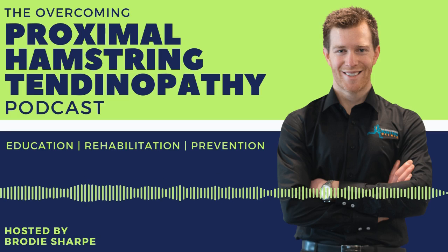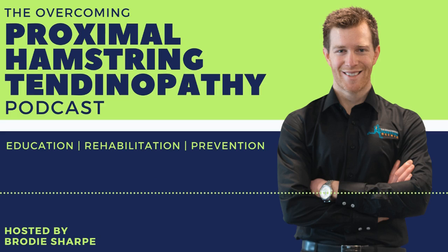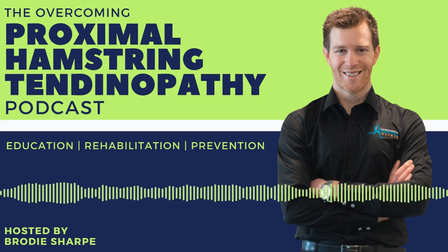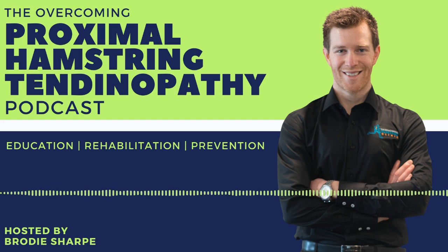A lot of patients call me after 3 sessions and tell me they're not happy. And I say to them, your tendons, your collagen remodeling and everything, it takes a good 12 weeks. So we need to educate patients. Most patients, when I finish Shockwave, are only 20% better. And then you need to start loading them.